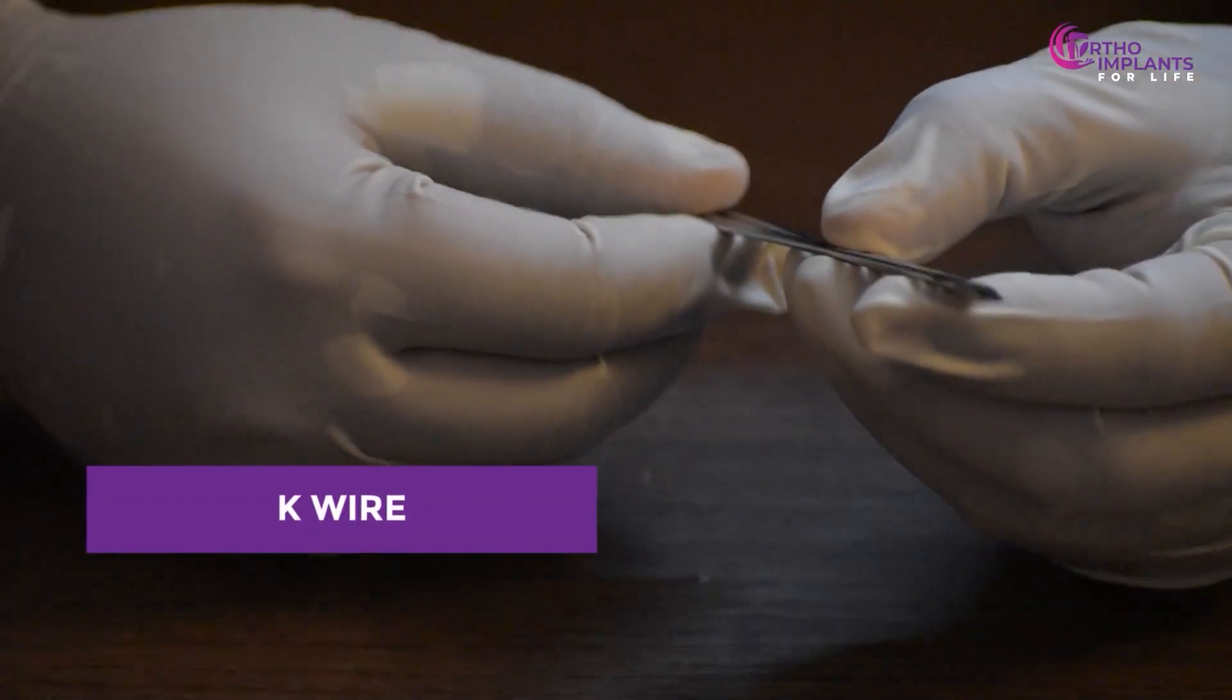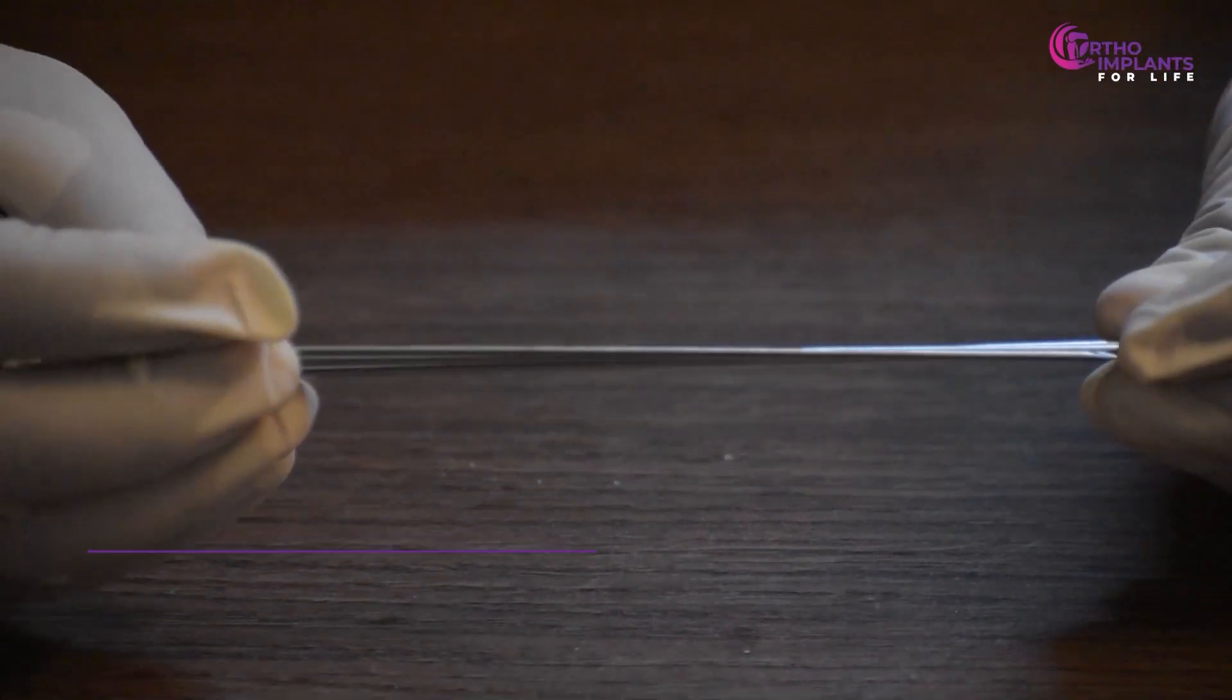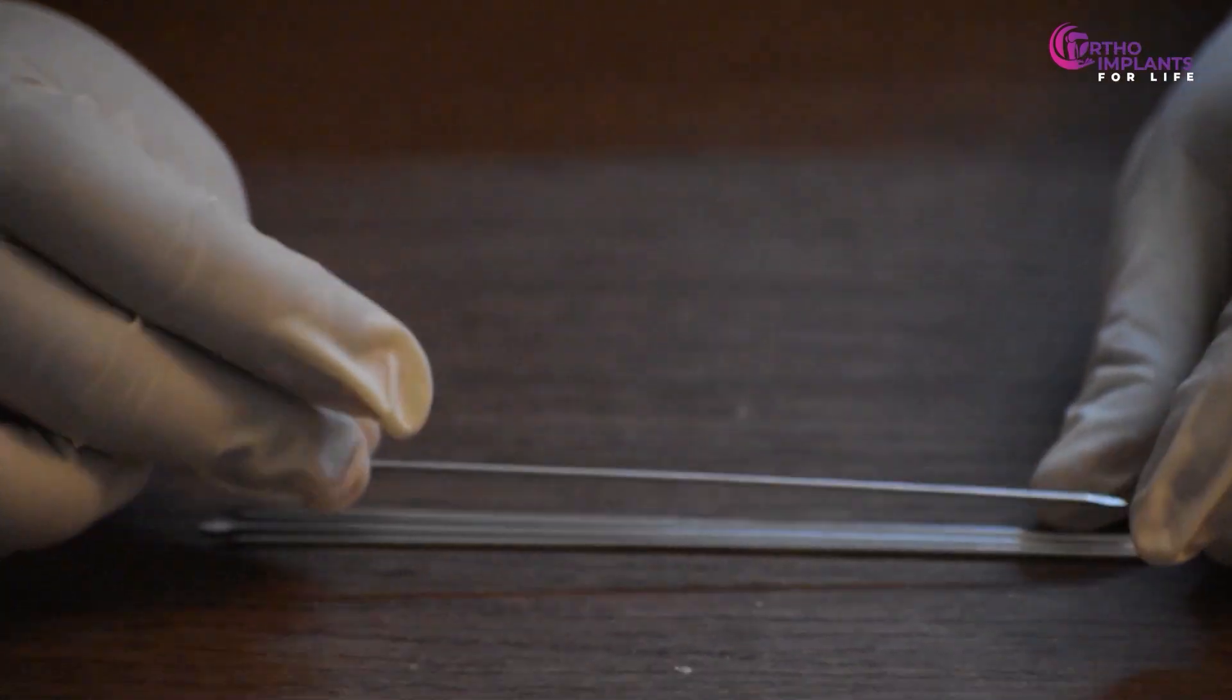Next, we have the K wire, which is 1.5 to 2.5 mm in size, used for holding the plate in place.